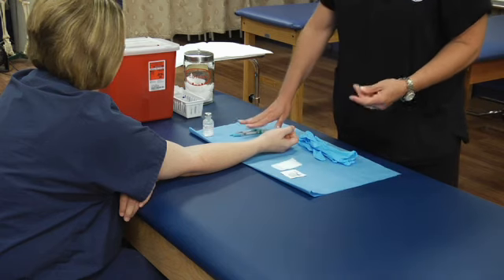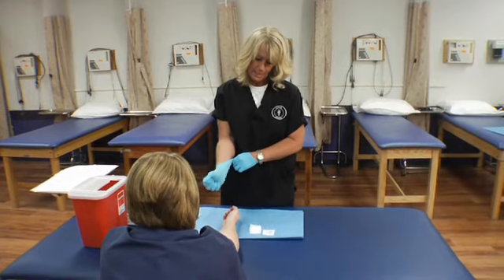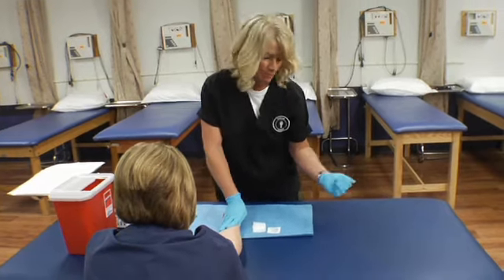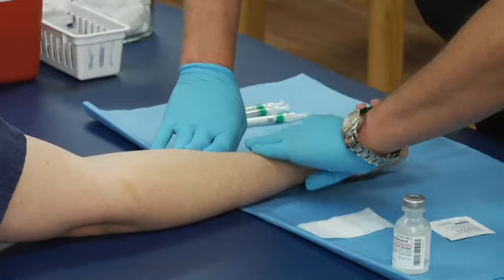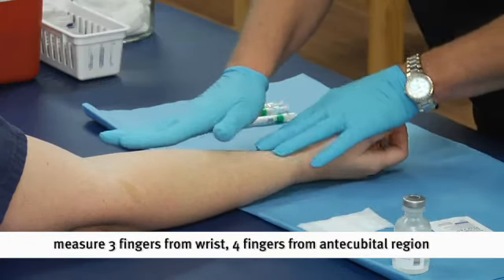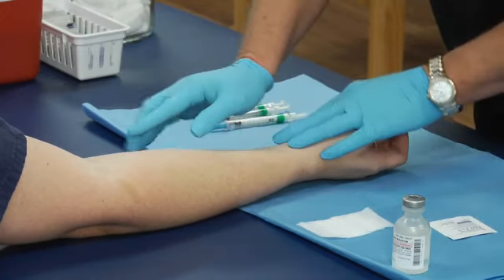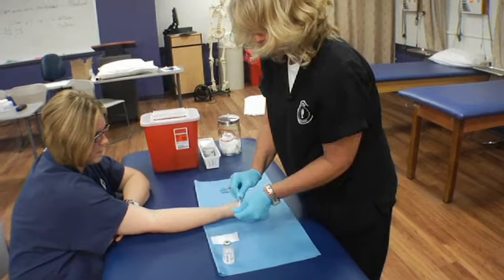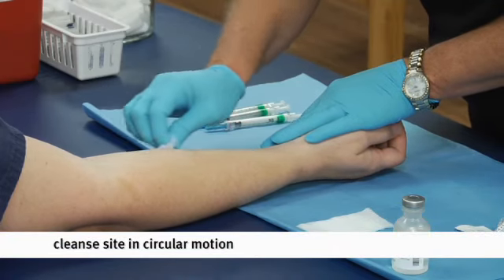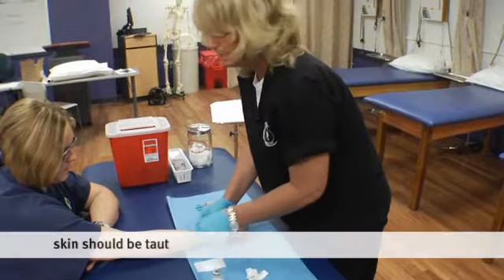Now that we have all of our supplies ready and our syringe filled, our first line of defense is to put on gloves. The trick to this technique is tight skin — we need to have tight skin. I'm going to measure using three fingers from the wrist and four from the antecubital. You can go anywhere in that area; we stay away from visible veins. She has no scars, tattoos, or burns to watch for. Then we use the honey-bun or swirl technique — I start at the center and swirl out, getting all the microbes out of the way. The skin must be taut.